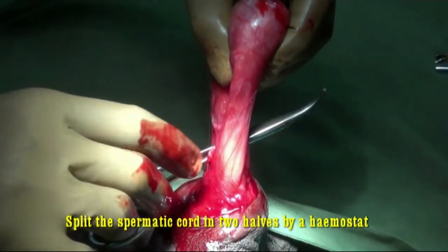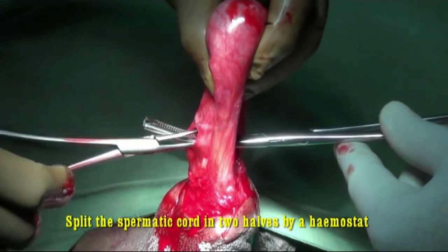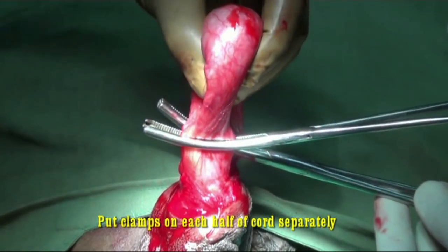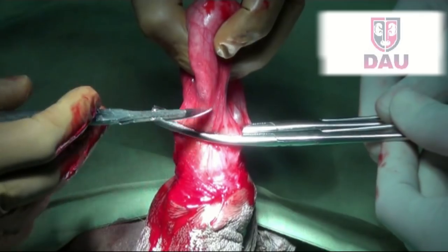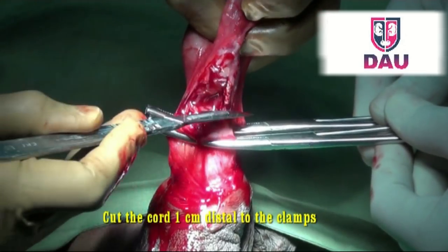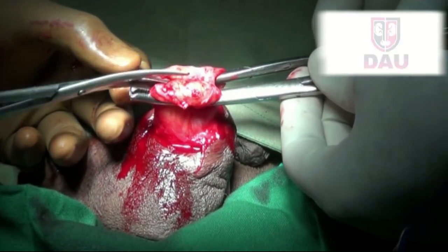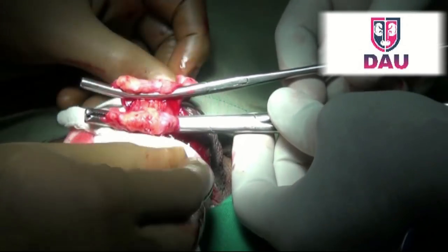Ask the assistant to put the clamp in on each side. When you cut, cut about one centimeter distance to the clamp that you put — don't cut flush with the clamp. I will tell you why this is needed. Cut about one centimeter distance to the clamp. The scissors separate these two halves and make them independent. So the spermatic cord pedicle is now divided into two equal halves.